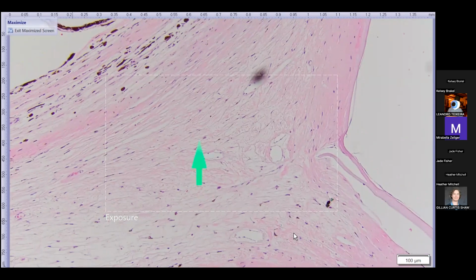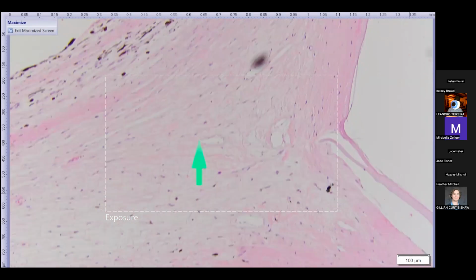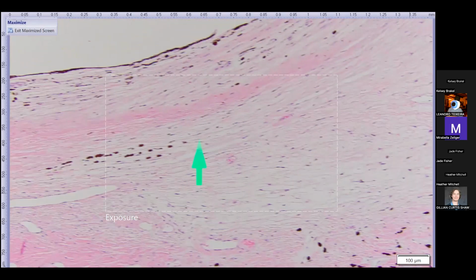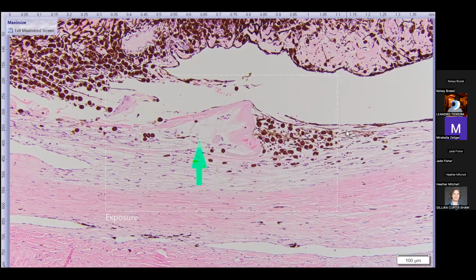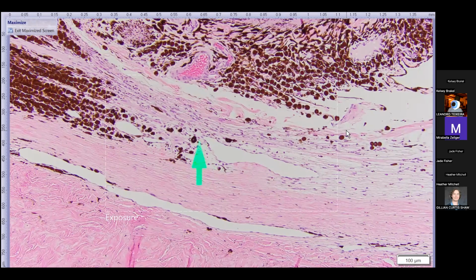Here's the end of Descemet's membrane on one side. You can see the Descemet's membrane is also doubled, which is kind of a common thing that happens when Descemet's is disrupted. And maybe I lied, and there we go. Here's the other end of Descemet's. I pointed out the wrong spot on the lower magnification image, but here's the other end. So we have a peripheral rupture, and then that distortion extending into the supraciliary space and distorting that ciliary cleft.